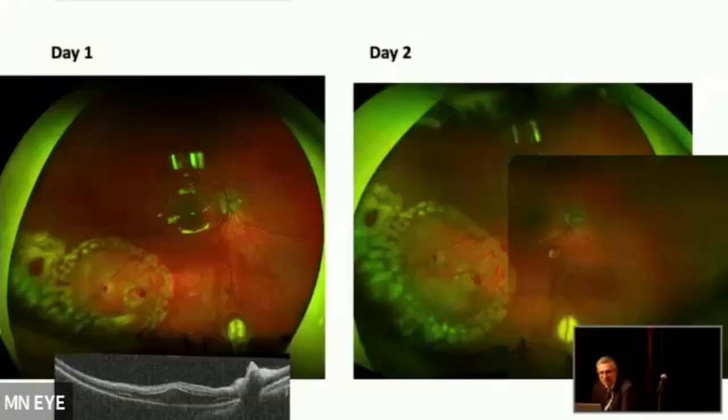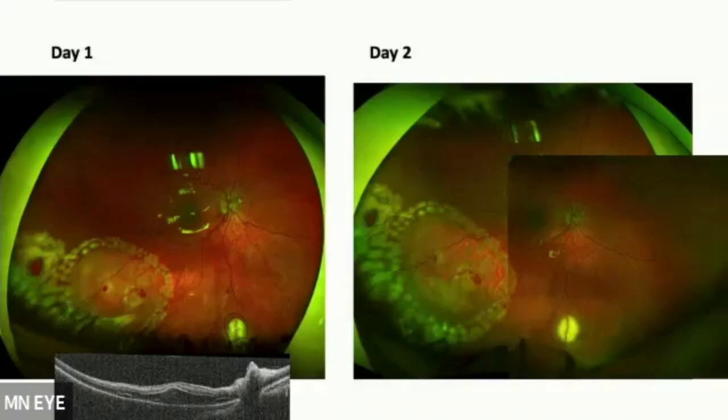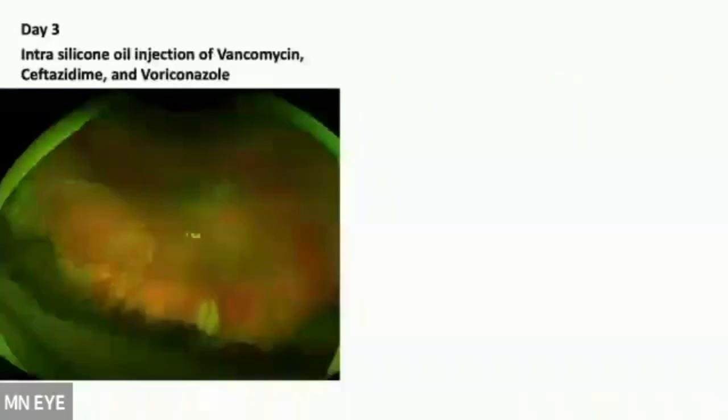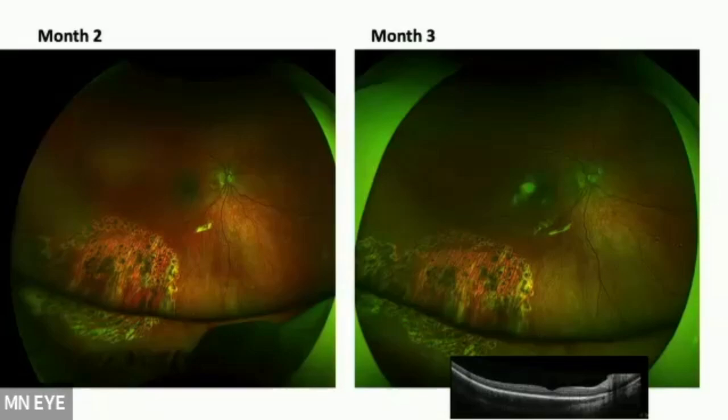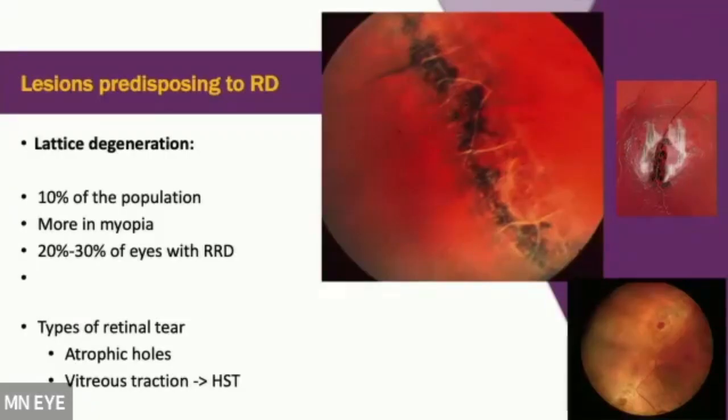So, okay. Anyway, look, this is an endophthalmitis and retinitis, and I have more pictures. These are pictures from day 1 and day 2. It's already developing an abscess, even outside the impact site. So oil is in the eye, but this is day 3 or maybe day 7 or whatever. I injected antibiotic multiple times, and it's getting better. And then you saw the 1-year follow-ups.